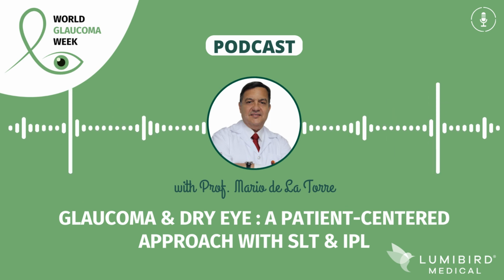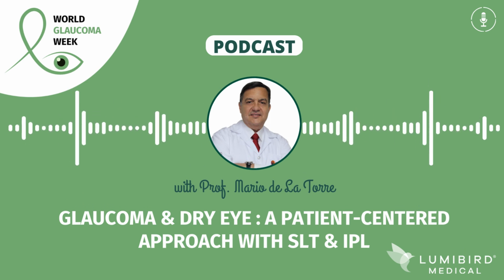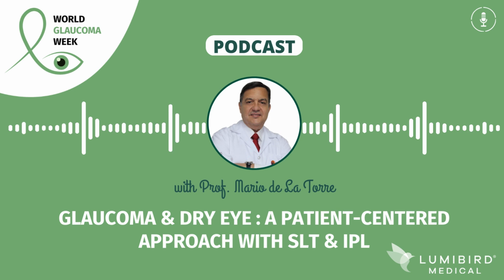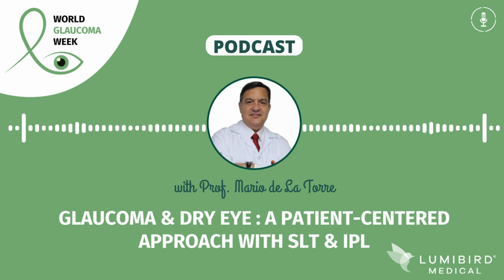And we started with the treatment of intense pulsed light, the IPL therapy. What is the rationale of this? We're targeting the periocular area in order to improve meibomian gland function. The protocol includes 4 sessions, spaced 10 days apart. It could be 7 or 12, it all depends. And we combine it with eyelid hygiene measures. And the result was promising. His eye lubrication improved, irritation decreased, and he could tolerate the glaucoma treatment better.